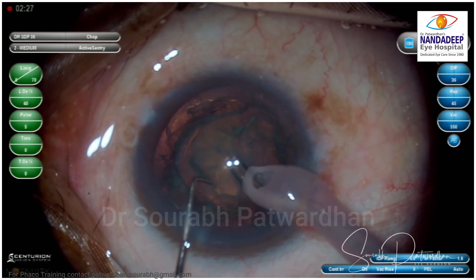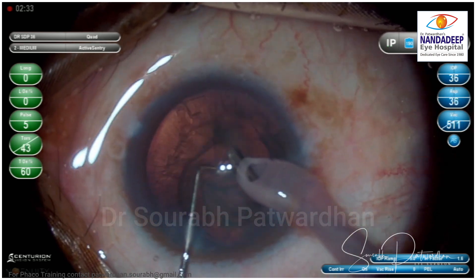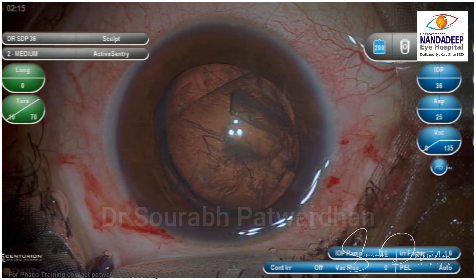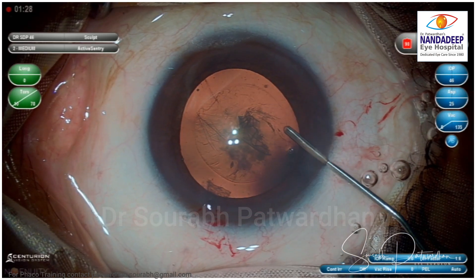Of course this is a very useful technique. So I decided I would study the cases where it was successful for me and try to find what I did right in those cases. The purpose of this video is to tell you how to make this technique more predictable — the ways or tricks which can make it very predictable so you can use it in every soft grade of cataract.